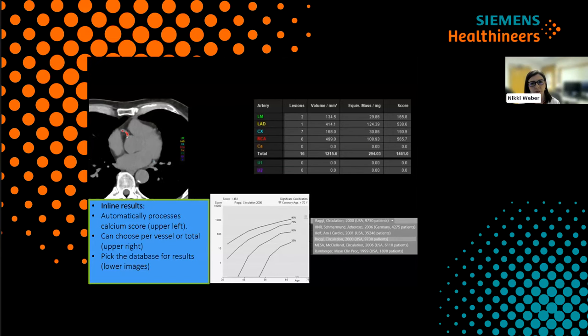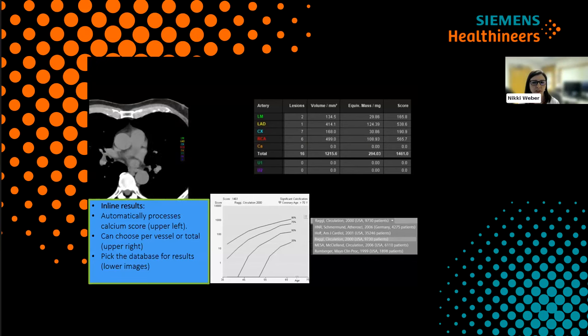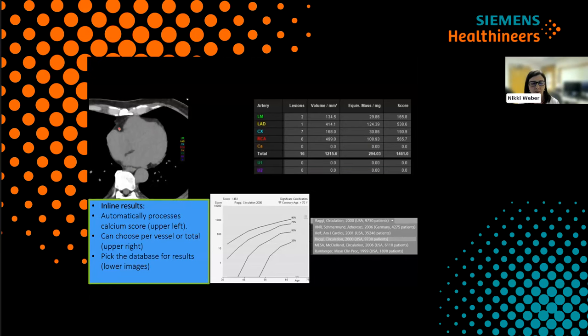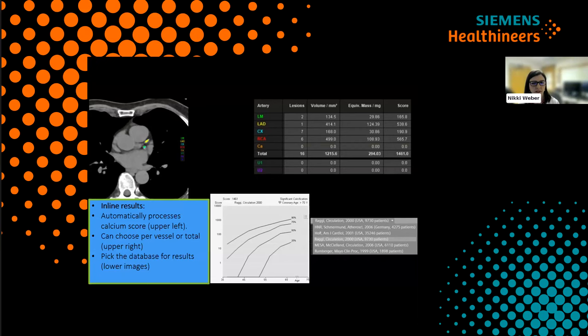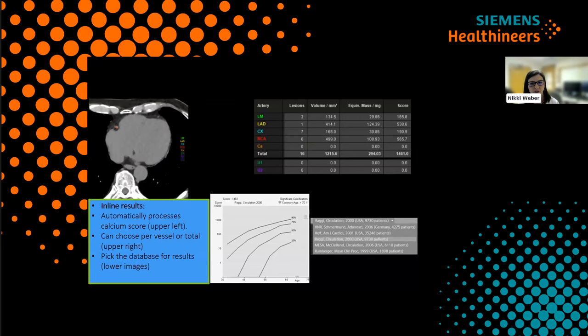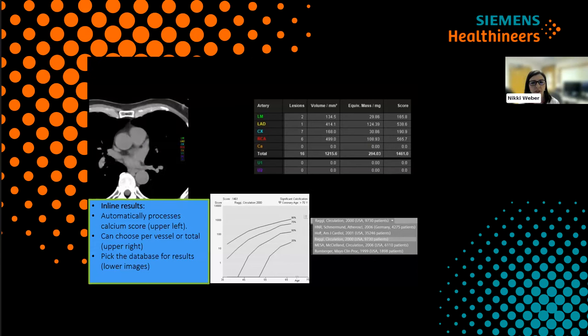At our facility, we do not routinely do calcium score imaging prior to a coronary CTA. The images are sent to the 3D lab for post-processing, but that doesn't mean that we can't gain efficiencies from this particular feature. One less exam the 3D lab has to process, or less work for them to do once the exam arrives in their workstation. The radiologist benefits because the images get to their reading workstation faster.